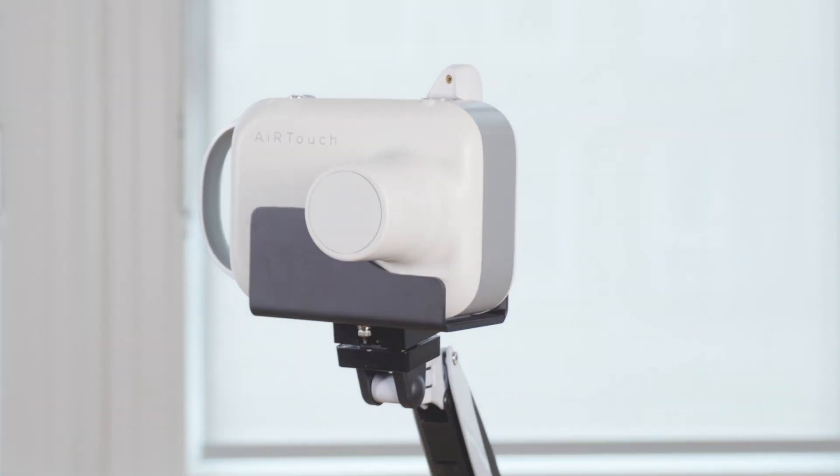And remember, this is an x-ray device, so please follow all local radiation safety laws and guidelines. Contact us to learn more about Europa. Thank you.